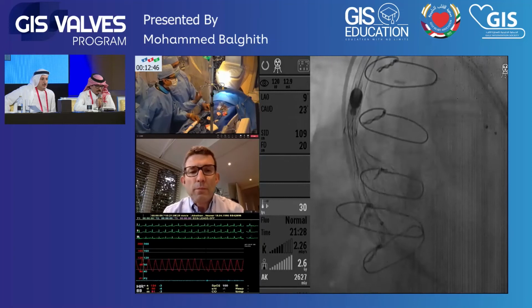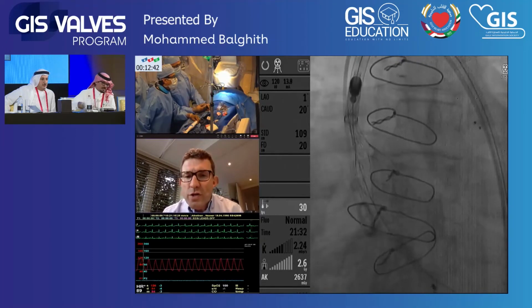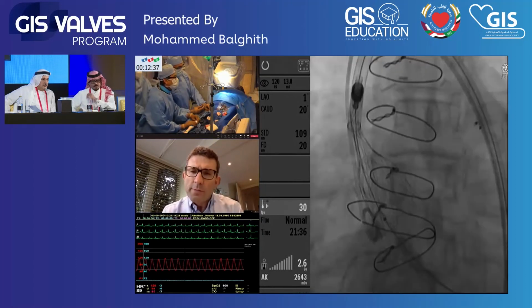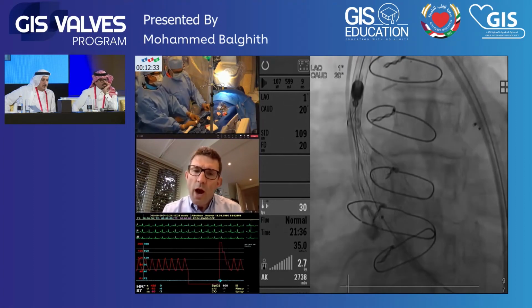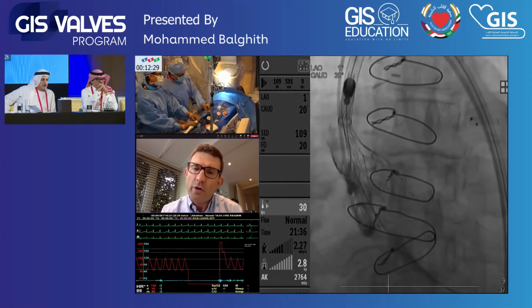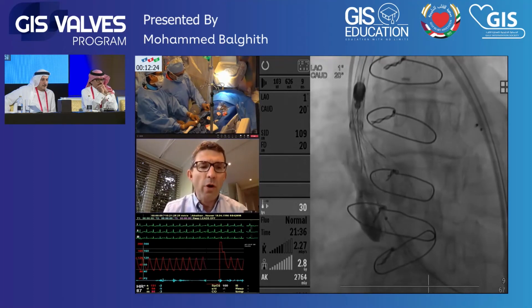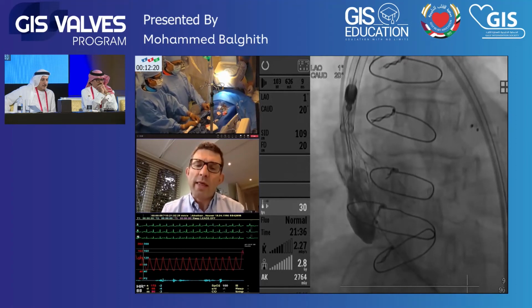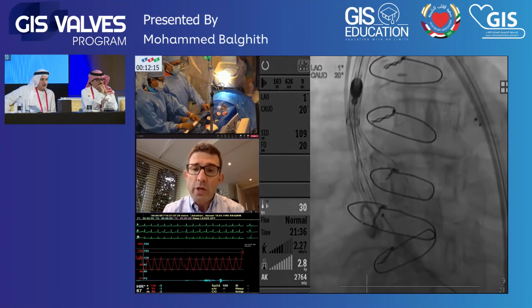Less caudal? Now it looks higher than what we want. That looks reasonable, I think, to me. Can we take a picture? It's higher. It's high. Yeah, so I think on the non-coronary side, ironically, on the left it looks good, but on the non-coronary side you are at 0. You are level with the cusp. I don't think that would therefore give you a safe post-dilatation option if you needed it.